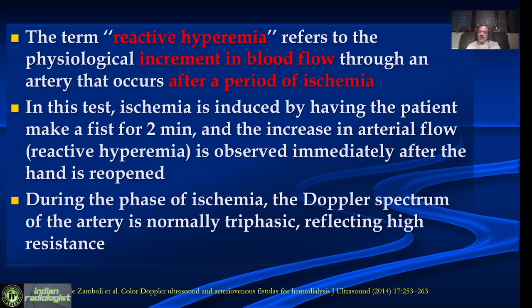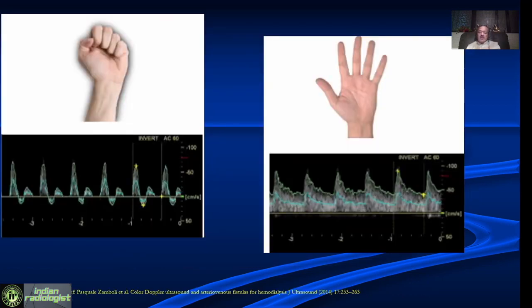There is also a test known as reactive hyperemia, done typically before fistula creation. We look for an increment in blood flow after a fist clenching exercise. This test tells us whether the artery is able to dilate adequately after ischemia — and once a fistula is done, there is increased demand, and the artery should be able to cope with that increased demand. We ask the patient to hold the fist tight, evaluate the radial artery — typically a very high resistance waveform — then ask the patient to release the fist, and after releasing, we see an increase in diastolic flow, telling us the artery is good for dialysis.